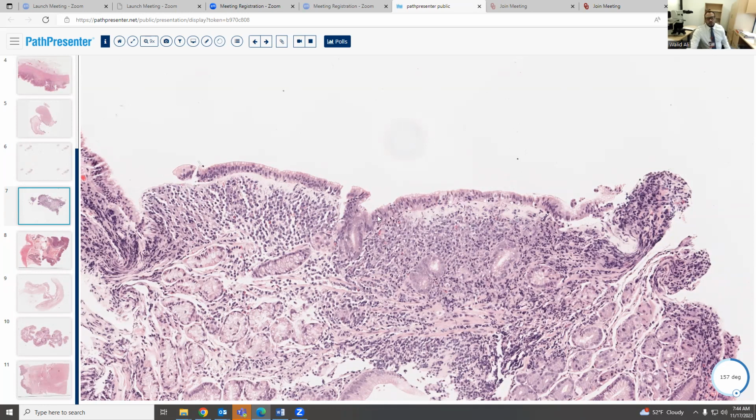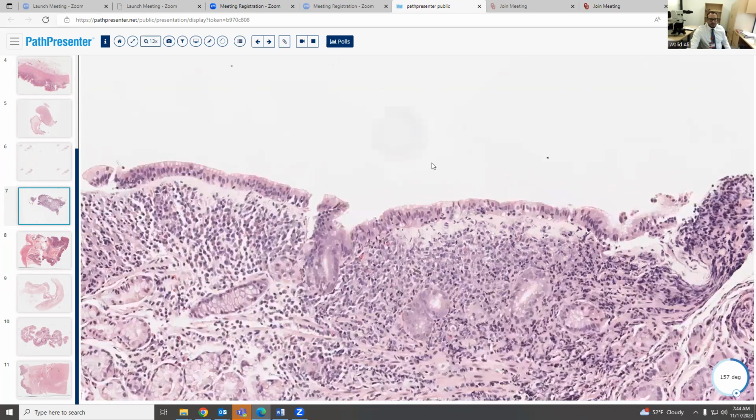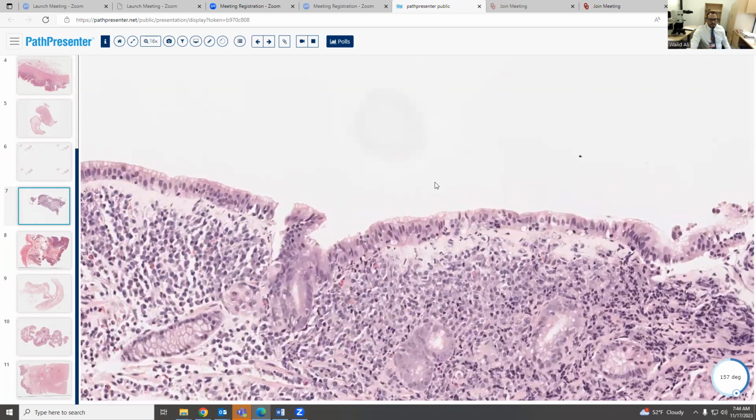Lymphocytic colitis is more common. In lymphocytic colitis, you should see abundance of lymphocytes in the epithelium, like intraepithelial lymphocytosis. There's a criterion also, they say 20 per 100 enterocytes, but usually no one uses it as long as you see a lot of lymphocytes in the epithelium.